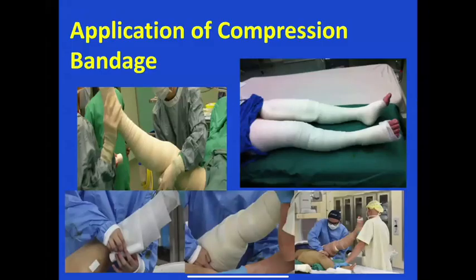And I tend to put in a 2-layer compression bandage myself, using a soft band crepe and a Coban light dressing. I tend to leave it on for 24, 48 hours, and I let the patient take it off. I then offer the patient a stocking for 5 days. I tend not to do 2 weeks anymore, because I don't think they can actually tolerate it.